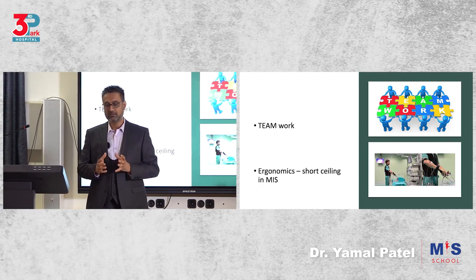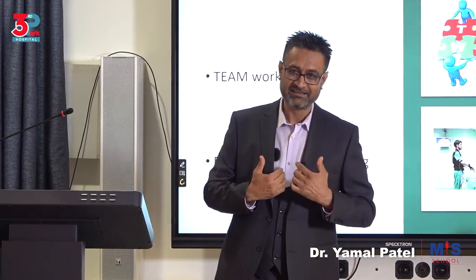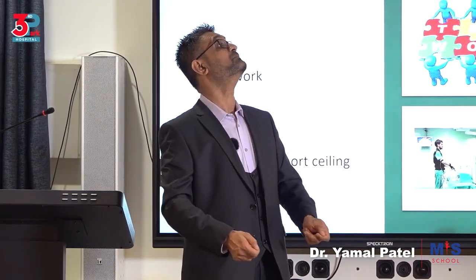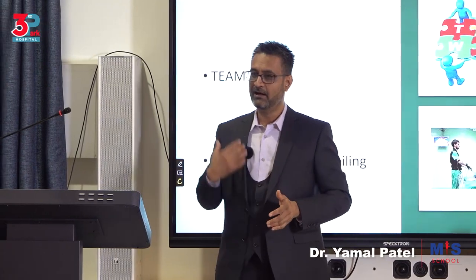What does that mean? We'll briefly go through ergonomics, but what it means is it's very easy to injure yourself. We always think patient, patient, patient, yes, but in MIS we'll also have to think us, because if you don't, you'll injure your shoulder, you'll injure your wrist, you'll injure your neck because of constant bad positioning of your head to the screen. So please, you need to know ergonomics.